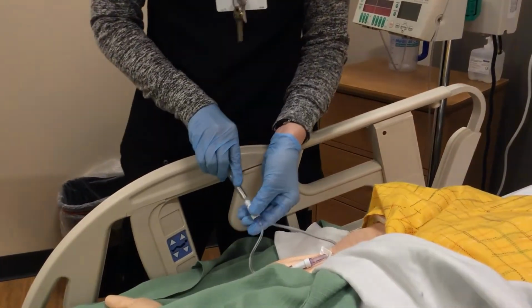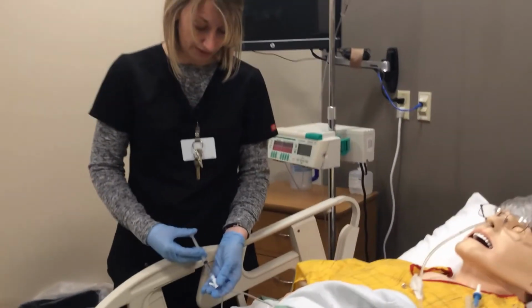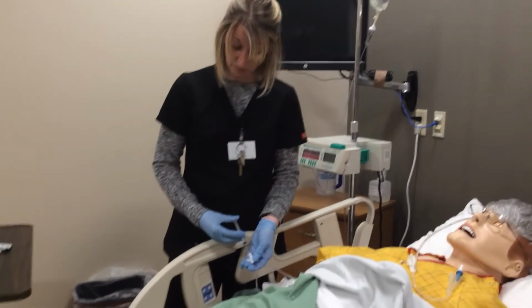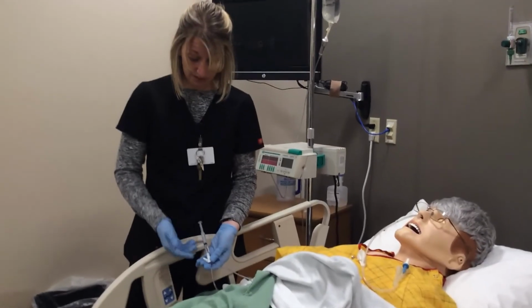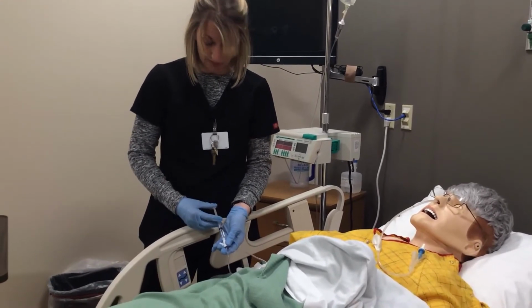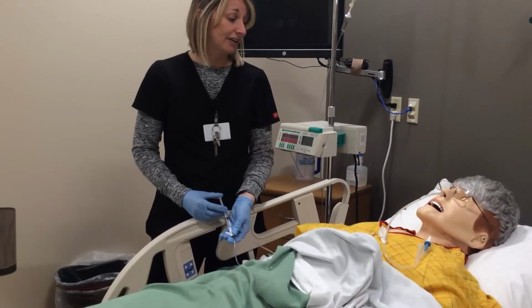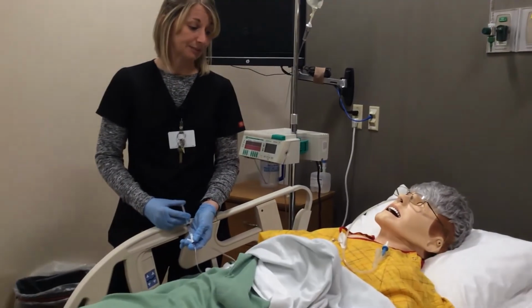And here I'm watching the clock, and I'm going to push it over that 3 to 5 minutes like I looked it up for beforehand. So again, with this one, if it's compatible, I'm not going to release this line at all or anything like that. I'm keeping it pinched. And I'm just going to gradually push it, and again, having a conversation with my patient.